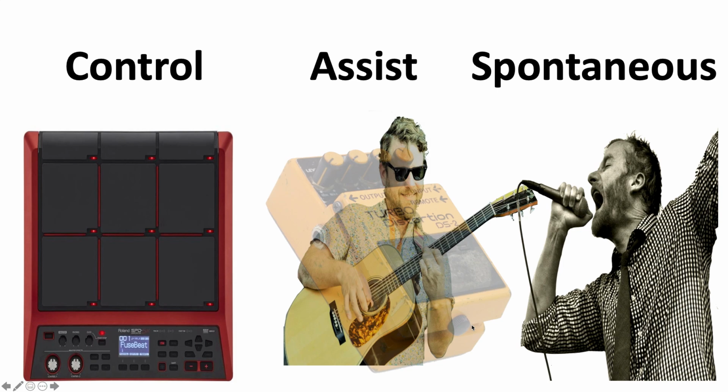And the spontaneous breaths are like the vocals, the singing. The patient or the singer is initiating that action and doing pretty much all the work. Now you can get some support through a microphone amplifier, but for the most part, the patient or the singer is doing the work.